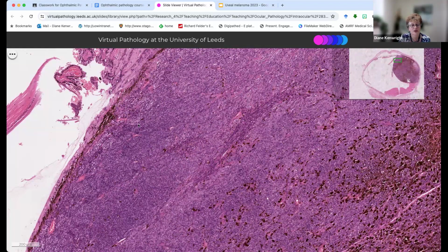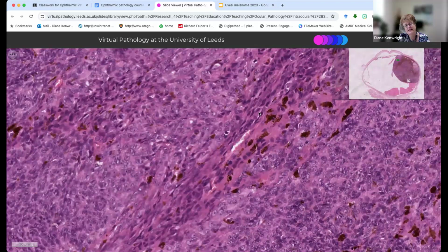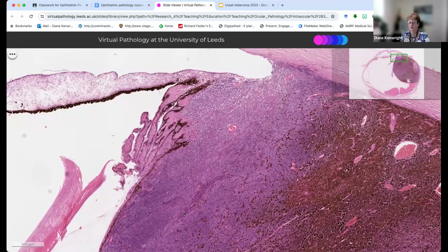Okay, so these are probably spindle cells here because they're much smaller than the other cells. But then there are these things here, which could be some other cells. There's also smooth muscle because we'll be in the ciliary body. Okay, good, excellent.